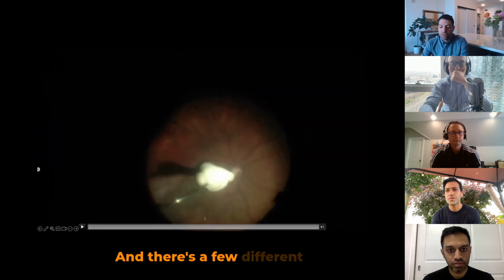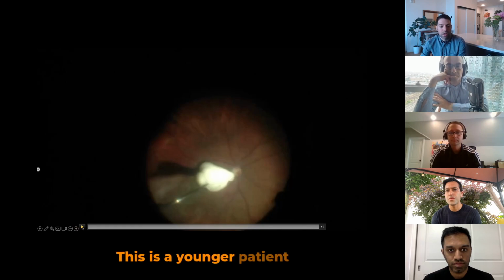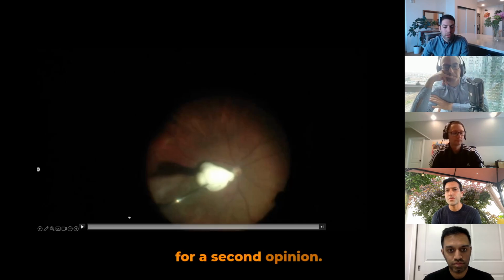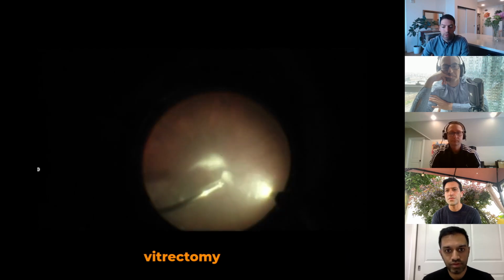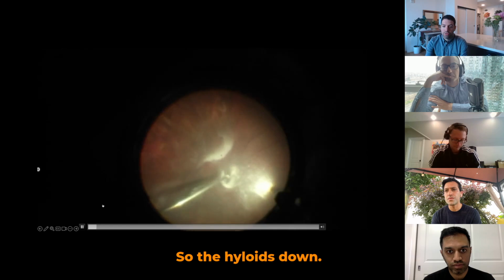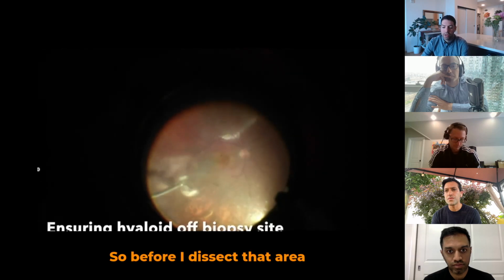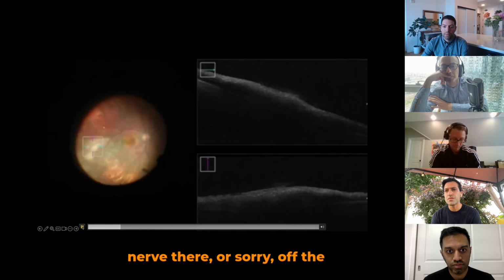And there's a few different ways to do this. So this patient also had a hyaloid that was down. This is a younger patient from Buffalo for a second opinion, who had already had a diagnostic vitrectomy that was negative. Oops, sorry about that. So the hyaloid's down. So before I dissect that area temporally, I want to make sure the hyaloid is off the nerve there, off the lesion that I'm going to dissect.